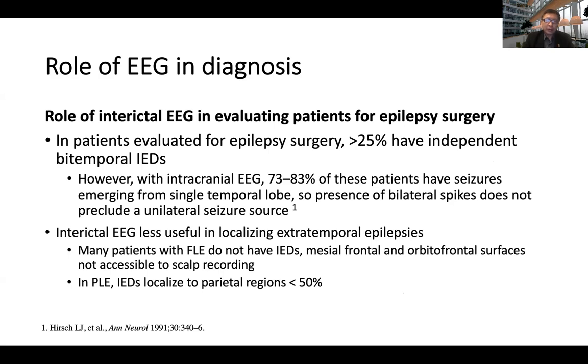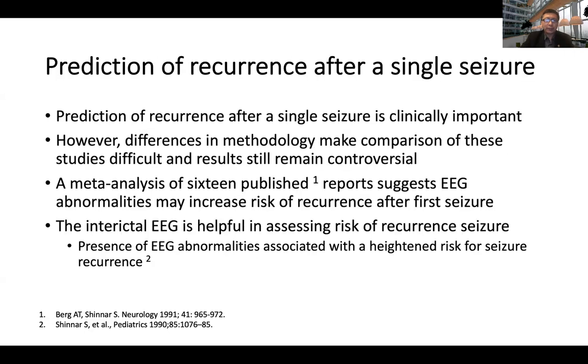Interictal EEG is less useful in localizing extratemporal epilepsy. Many patients with frontal lobe epilepsy do not have IED. The mesial frontal and orbital frontal surfaces are not accessible to scalp recording. In parietal lobe epilepsy, IED localized to the parietal region occur in less than 50%.